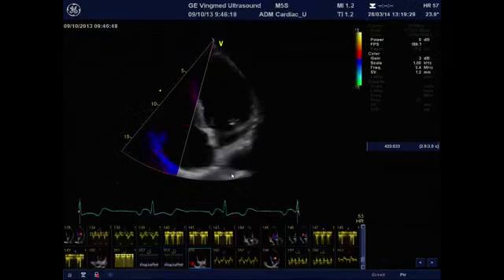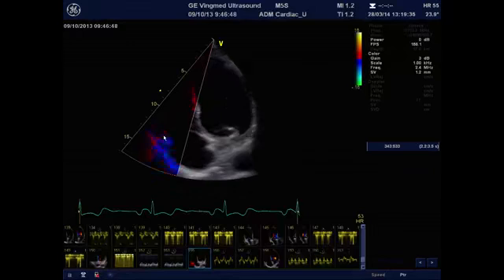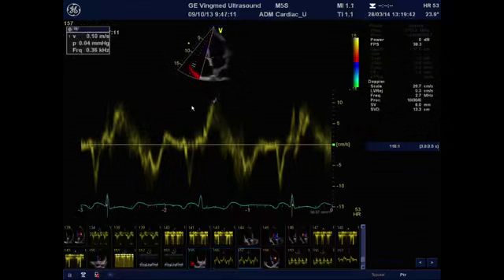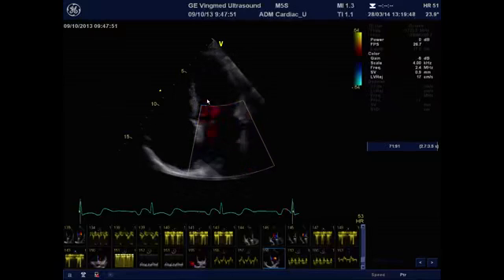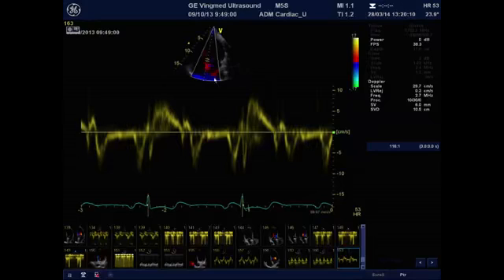And you could also assess the systolic velocity at the tricuspid annulus with the pulse wave Doppler and the tissue Doppler imaging, just like this. And also you should assess the left ventricular function. You should assess the diastolic inflow pattern at the mitral leaflet tips, just like this with the pulse Doppler, and you should measure the E and the A wave and the deceleration time, and also using the pulse wave Doppler at the mitral annulus at the septal and the lateral with the tissue Doppler imaging.